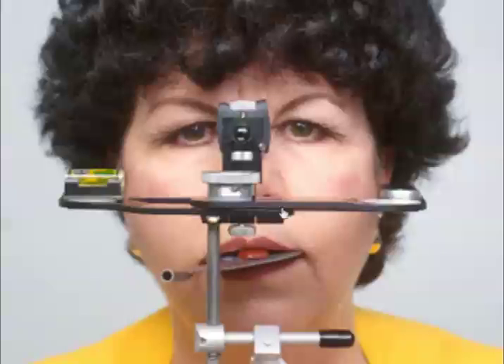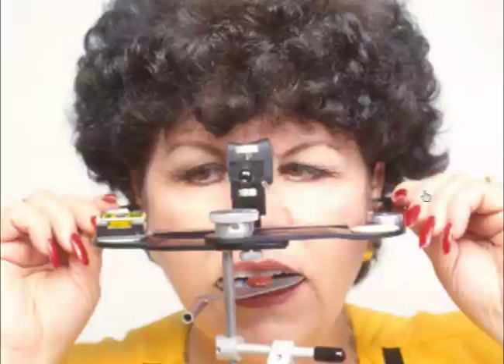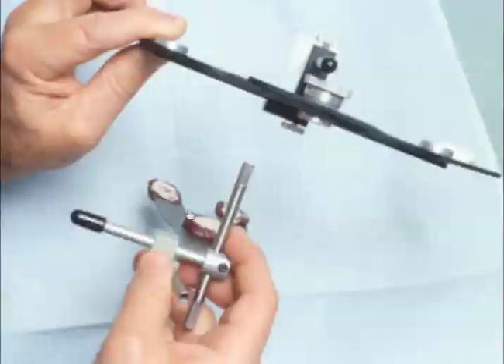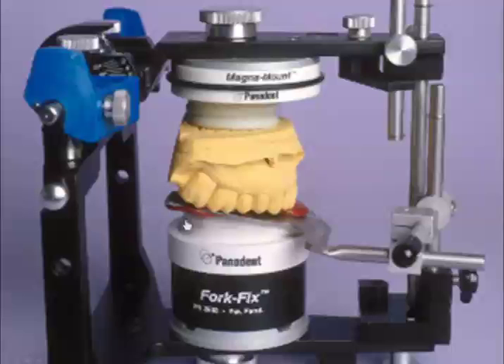Although the face bow is level from a profile view, once we look in the frontal plane, we can see this patient has one ear that's slightly higher than the other. So we can have the patient move the face bow in the soft tissue of the ears, leveling the face bow as they look at the level gauge. This will now free up our hands to go ahead and attach the clamps to the bite fork, and then we can take that bite fork to the articulator to mount the maxillary cast.